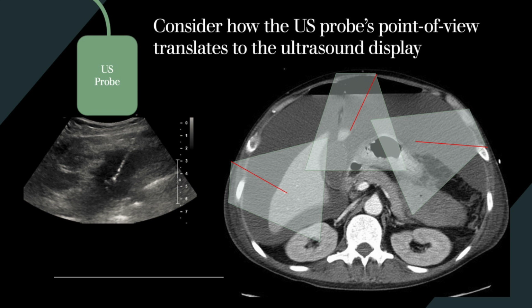So in this example, in all these positionings of the transducer, the image on the screen is going to be exactly the same. But as you can see here, the right lateral approach, the anterior approach, and the left lateral approach are actually giving us a direction of the needle that is completely different. Exactly. That's a very helpful point to make, Dan.